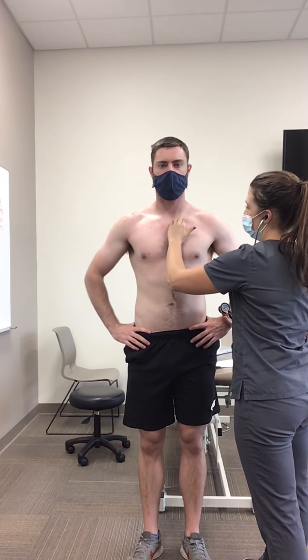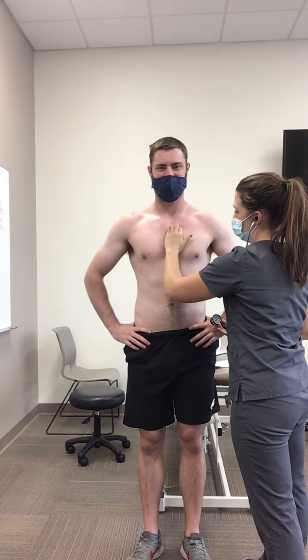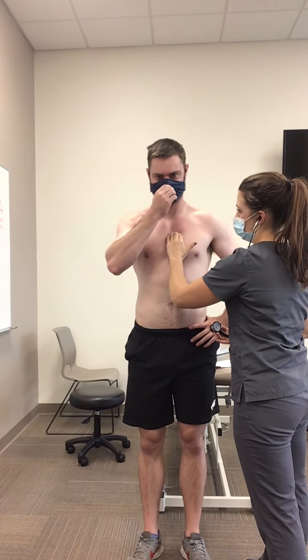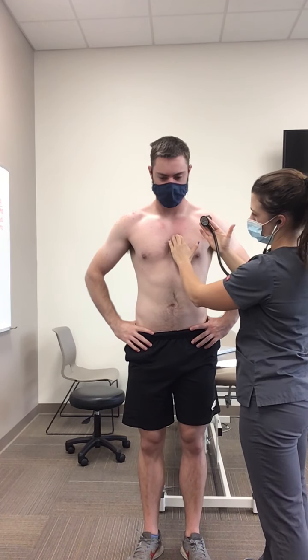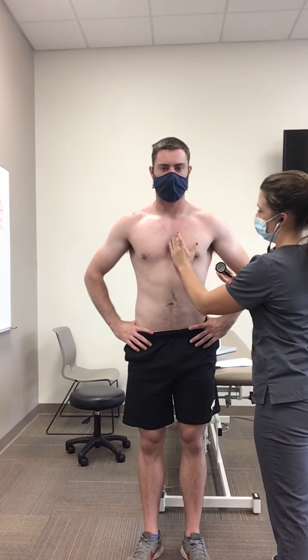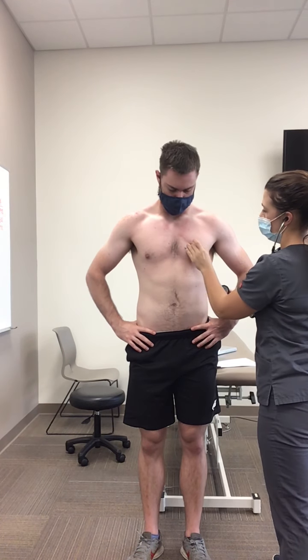After we hear the patient's pulmonary valve, we're then going to move from the clavicle, first intercostal space, second to the third and fourth intercostal space, coming again just lateral to the sternum. This will be in the fourth or fifth intercostal space, and this is for the tricuspid valve. After that, we're going to make sure that we're on the fifth intercostal space, come to the midclavicular line, and listen to the patient's mitral valve.